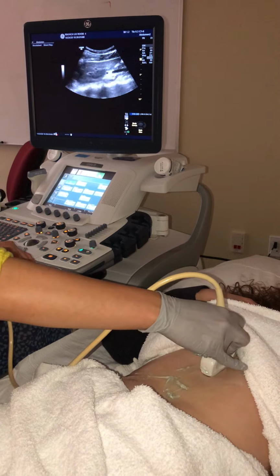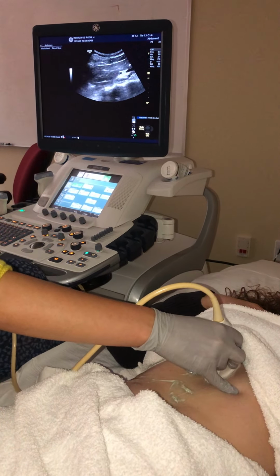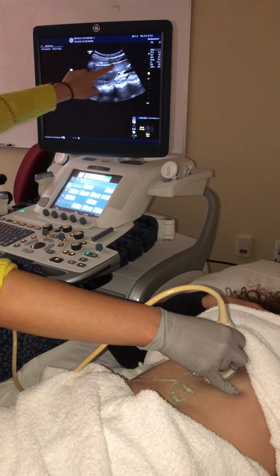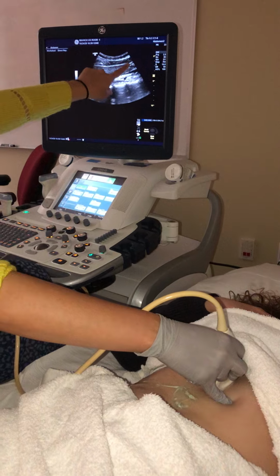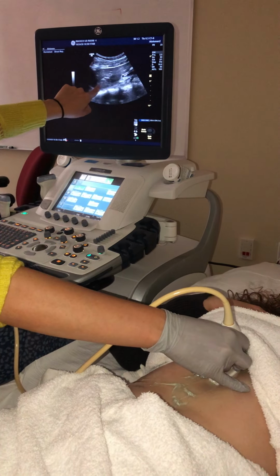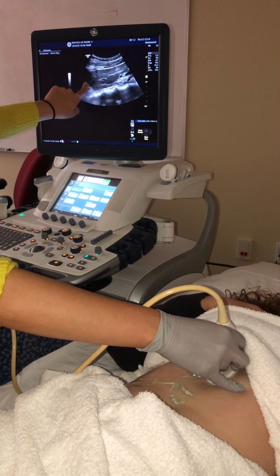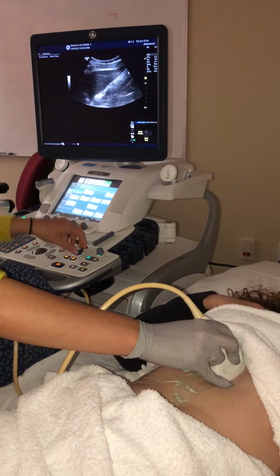So I'm pretty high up on her, even almost towards her chest. So here we have our sagittal left lobe. We're cutting off a little bit over here. We can move down to get some images of the tip of our left lobe. Move up to get that superior border up here. And we just want to sweep side to side in sagittal.